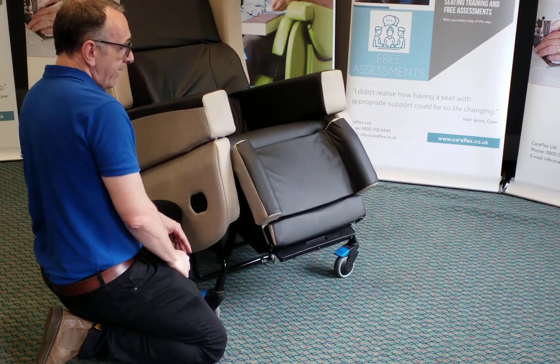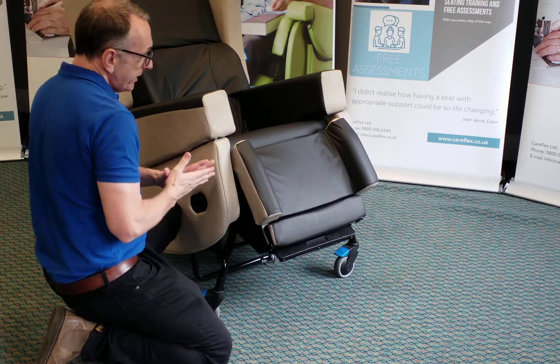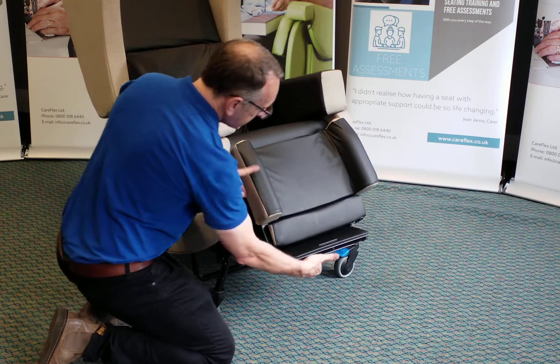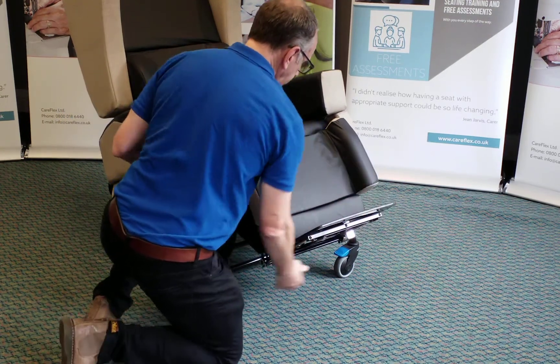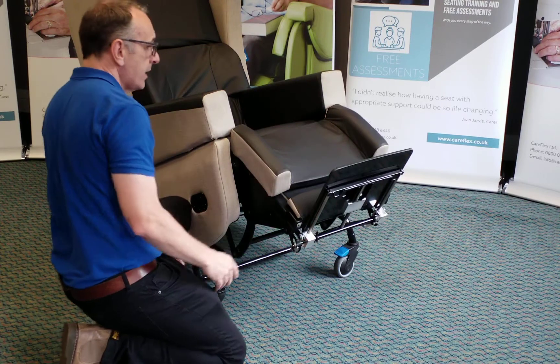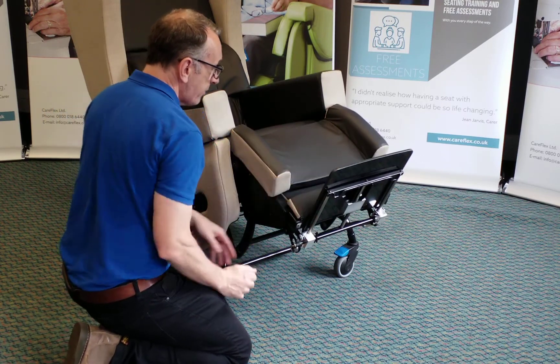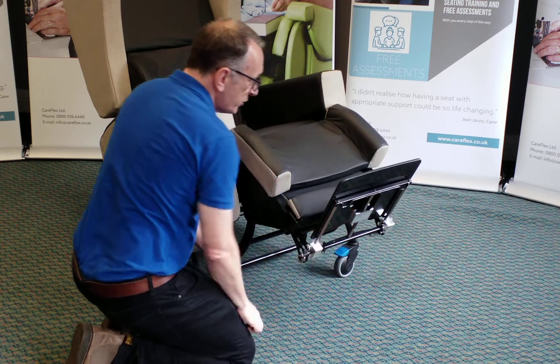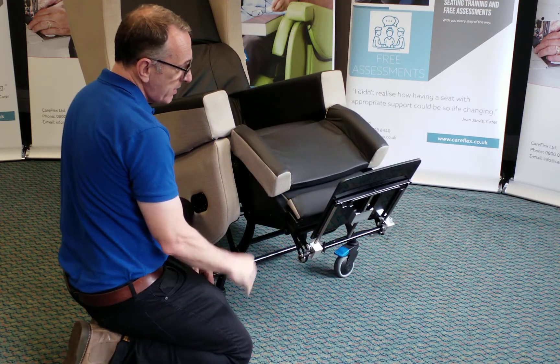It may be that we have a client with slightly longer legs, so we need to increase the length of the leg rest. If I release the foot plate and elevate the leg rest, on the reverse side of the leg rest there's a little plunger. Pull the plunger out and increase the length of the foot plate. There are three options.